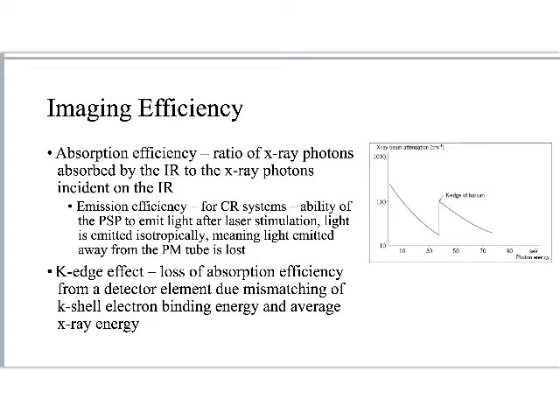I do want to talk a little bit about imaging efficiency because that is one way that we're limited by these digital systems, and it's a major engineering consideration. The 2 things that I think are most important for us in terms of thinking about imaging efficiency that's discussed in this chapter have to do with absorption efficiency. So how well does the barium fluorohalide or the amorphous selenium or the amorphous silicon absorb information in order to release it at a later time or release it into the TFT.